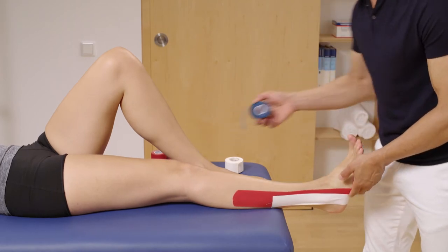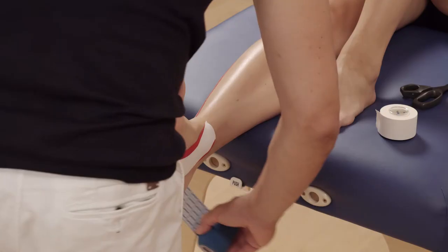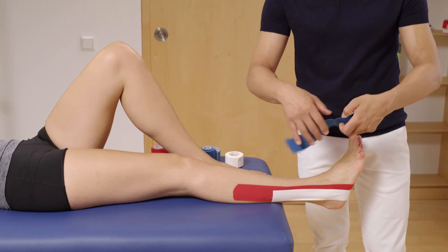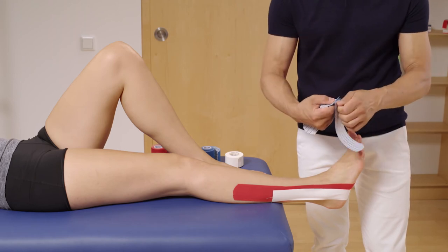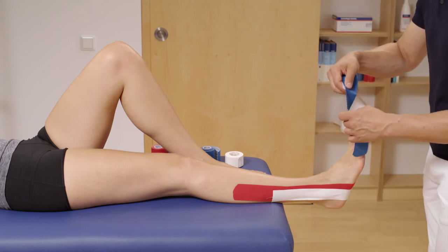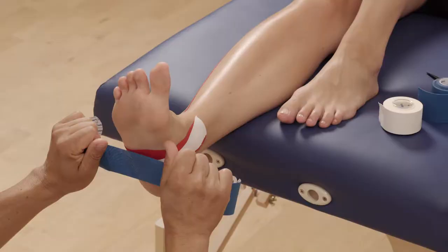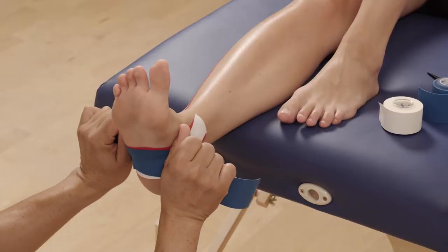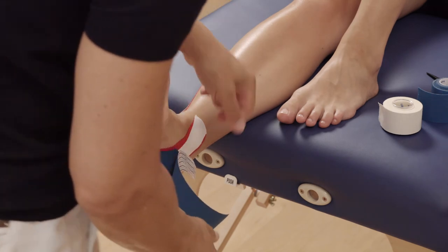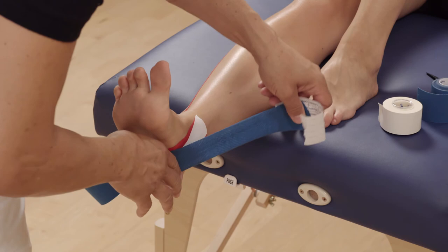Measure another LoicaTape K strip around the heel from the proximal end of the small toe to the proximal end of the big toe. Tear off the paper and open it up in the middle part of the strip. Stretch the tape to around 80% of the maximum elongation and apply it onto the sole of the foot. Remove the remaining paper on the medial part of the tape and with about 50% tension, lay the tape around the ankle.